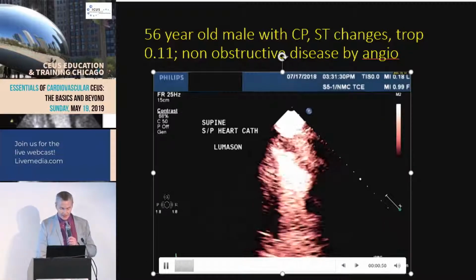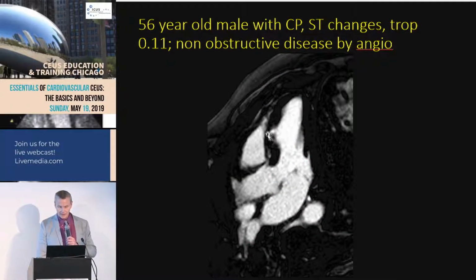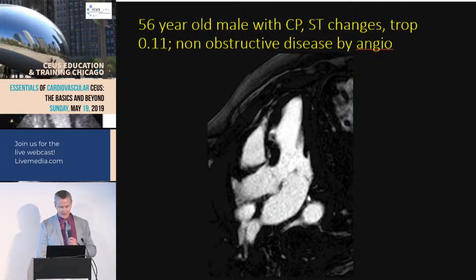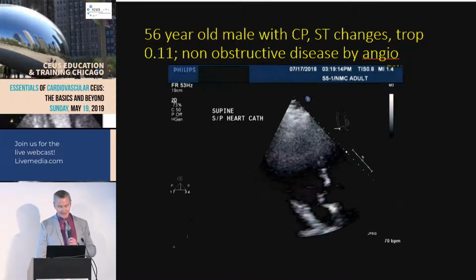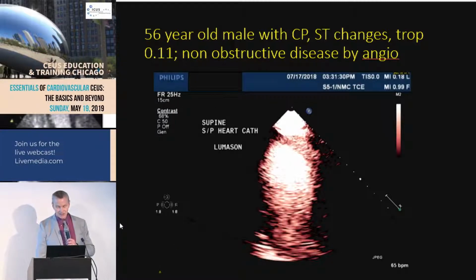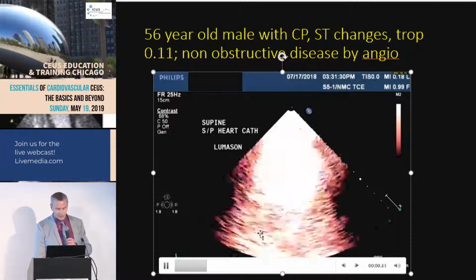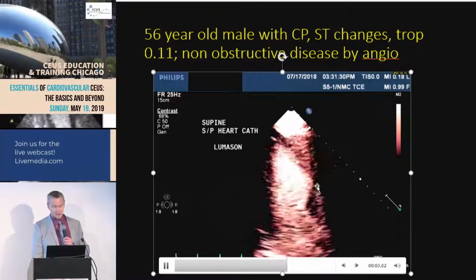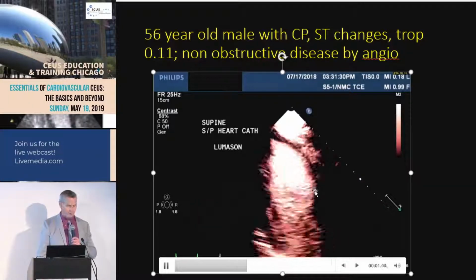Well, so they did an MRI, boom, focal delayed enhancement here in that mid-anteroseptal segment, just where we saw. They had to do the $3,000 test with gadolinium to answer that, but we could see it back here. Now, even after the MRI, you have to say, well, that still looks like kind of a subendocardial infarct there. We didn't know if it was a septal perforator or if it was prior myocarditis. But the point being, you can take a study that looks like this and change it to one that not only helps you see things in general, but picks up discrete abnormalities in the basal to mid segment, in this case mid segment really, that was clearly abnormal, had infarcted one segment.